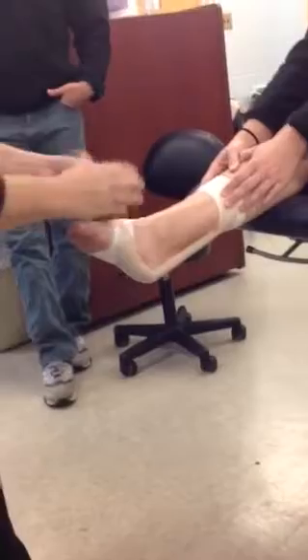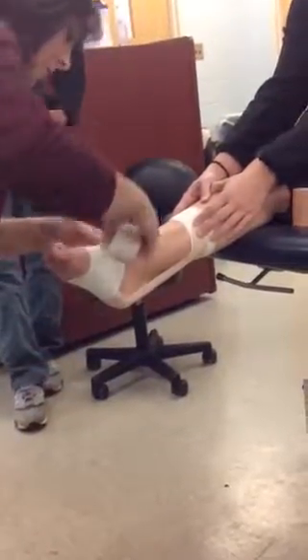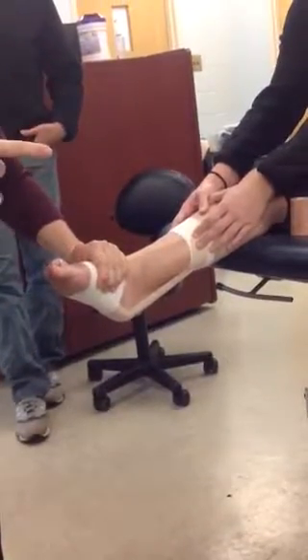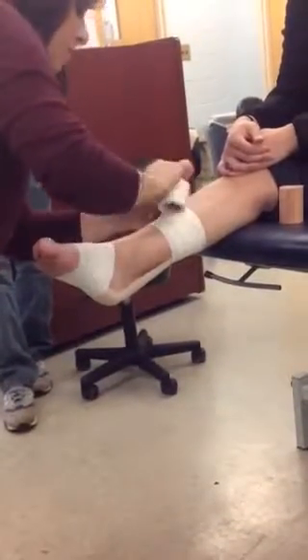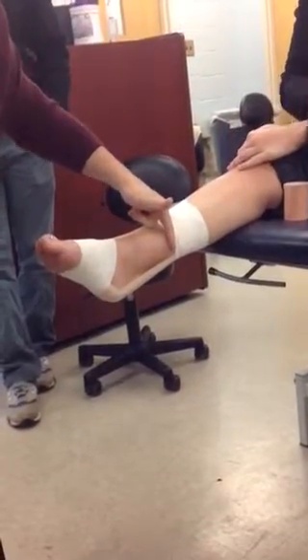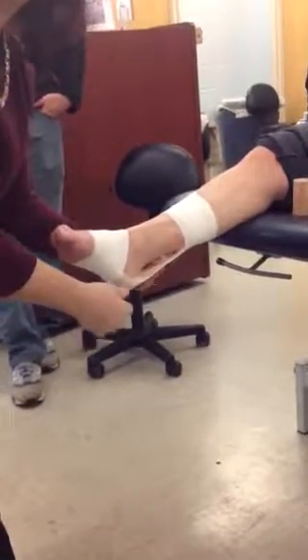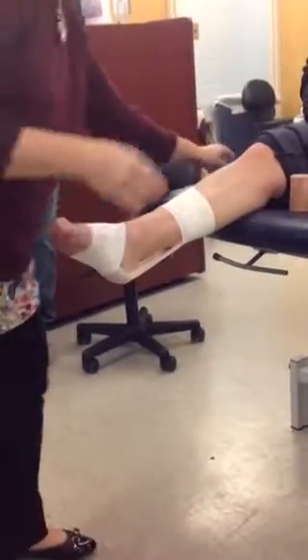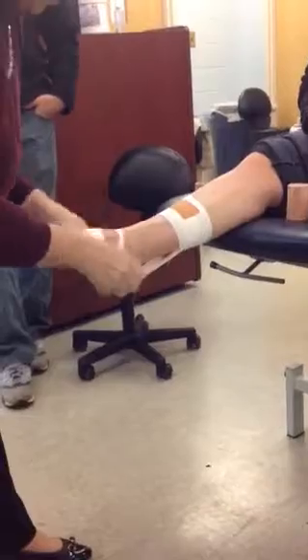I'm going to ask her to stay holding while I quickly grab the light plast and cover in — covering her foot a little bit, not just going once around to re-anchor but really filling it in. Then I come up top and do the same thing, filling it in just a little bit. Next, you fold the piece underneath it because all that sticky surface is back there and I don't want her to get stuck to it — so fold it inside itself. Then close the anchors with some Leuco tape, and now she can play.